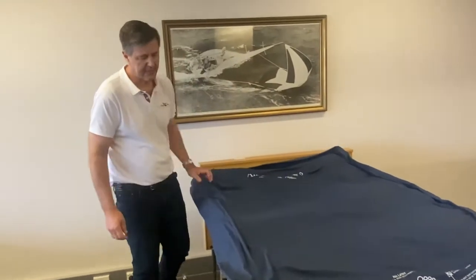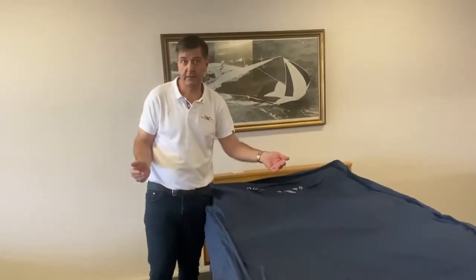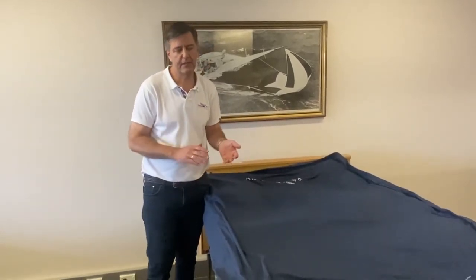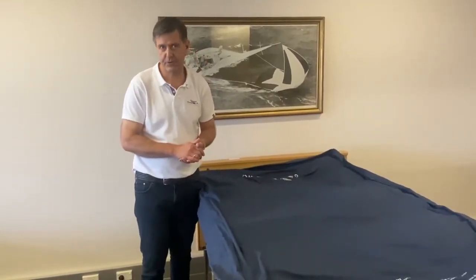Now, looped coverlets can come in both single and King Single sizes, depending on the application. But most of the time, you'll need to do it to a King Single mattress replacement.